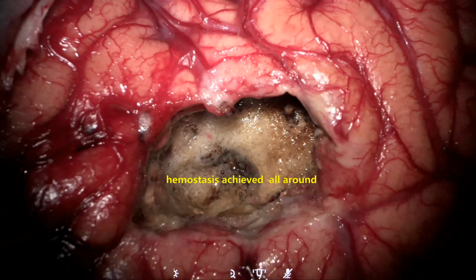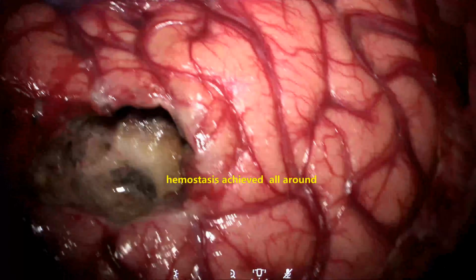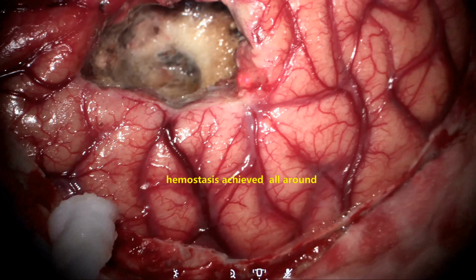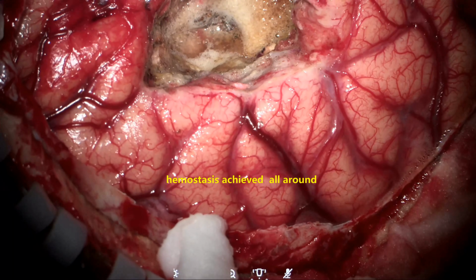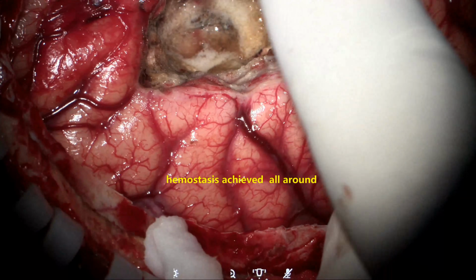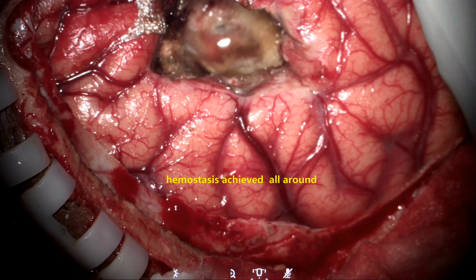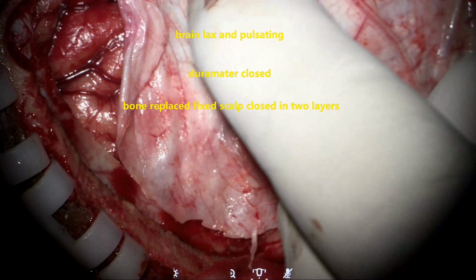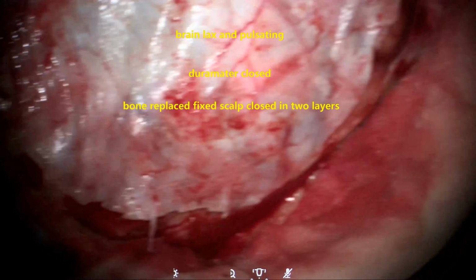Brain is lax and pulsating. You can see the complete excision of the lesion, and the brain is lax and pulsating, and the hemostasis is achieved and confirmed completely. Dura mater is brought back and closed with 5-0 or 6-0 Ethilon, as watertight as possible, as shown here. Bone flap is replaced and fixed.